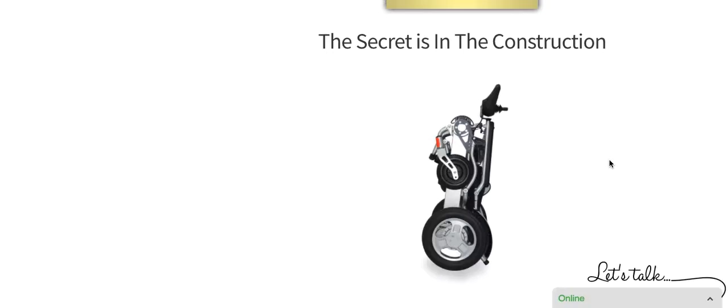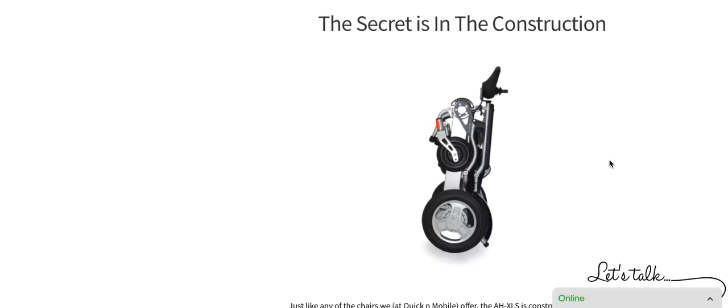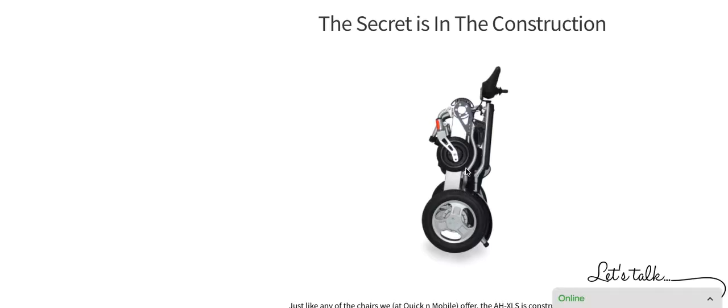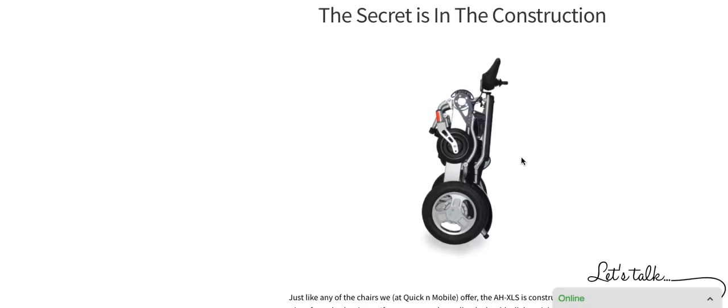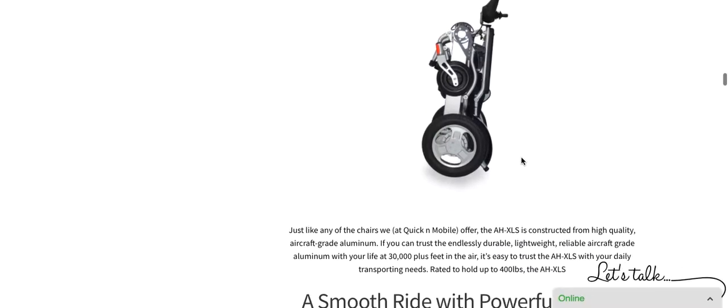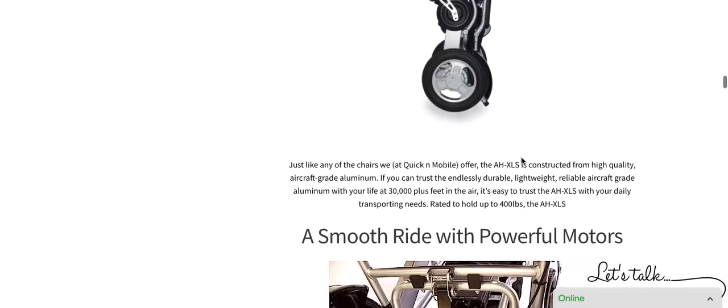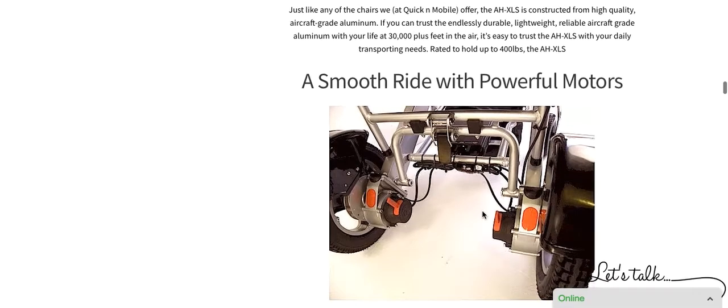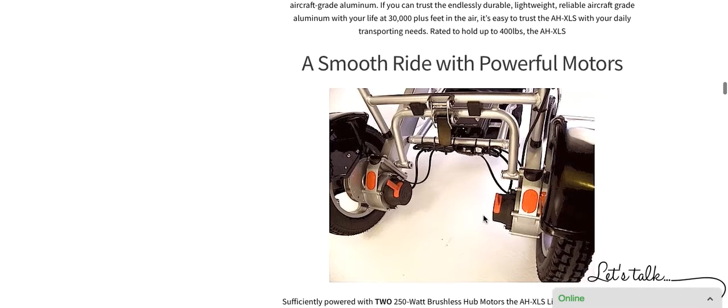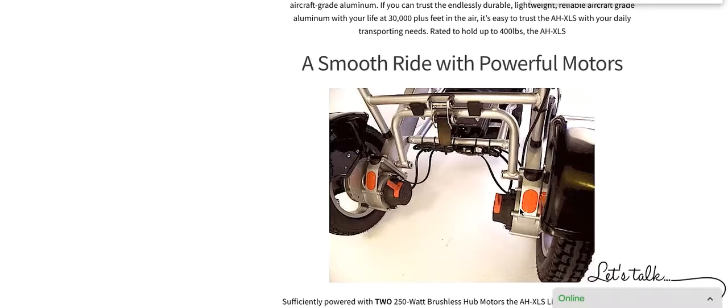It's a very powerful mobility device, a very convenient mobility device. It is constructed of aircraft-grade aluminum alloy. The same type of material that they build aircrafts that people trust at 30,000 and 40,000 feet into the air, that is what this chair is constructed of. You can see that the chair features two 250-watt brushless hub motors. Very powerful motors here, folks.